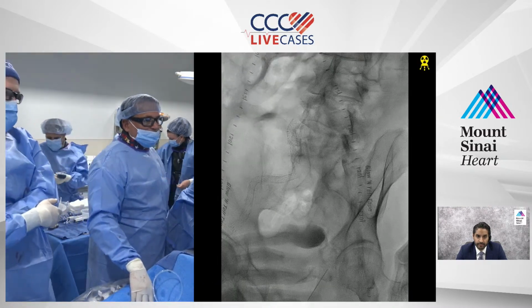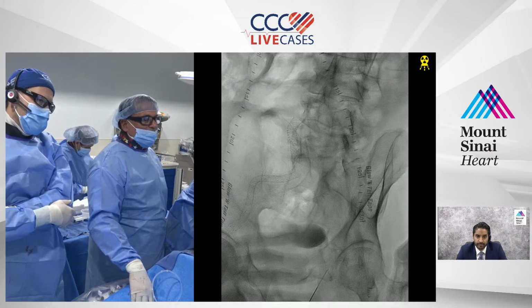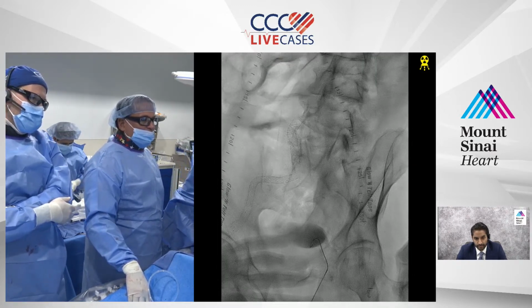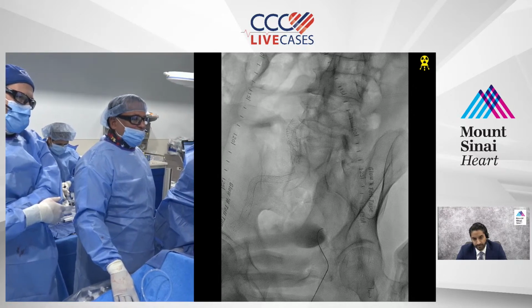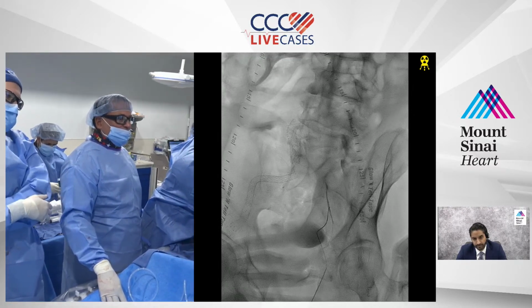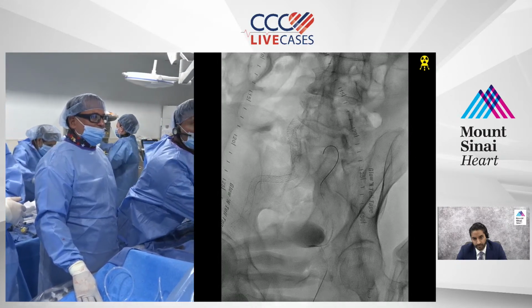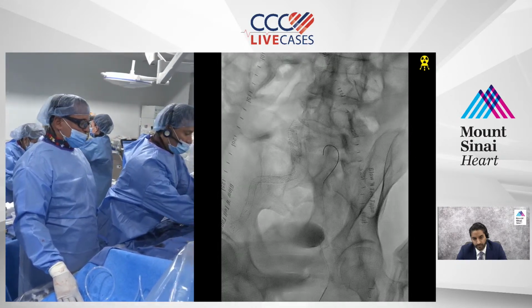Obviously, it's a very complicated lesion, so we decided to get multiple accesses. So here we've gotten the left access and the right access, and now Dr. Guja is just threading up a wire here. It'll get stuck in that spot like it did last time, maybe not. So there it is. You can see the amount of tortuosity that we're dealing with.